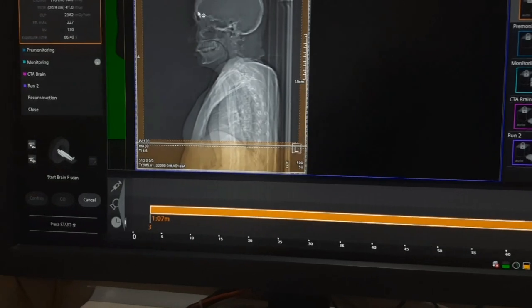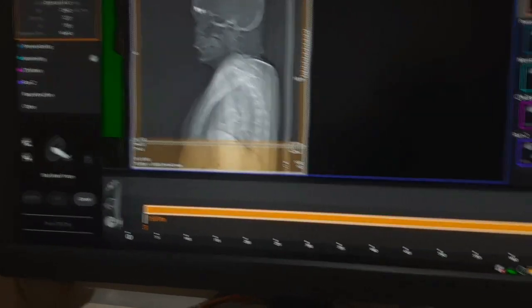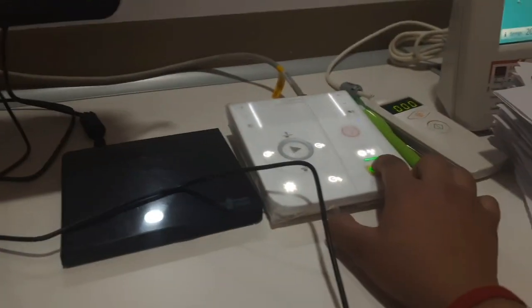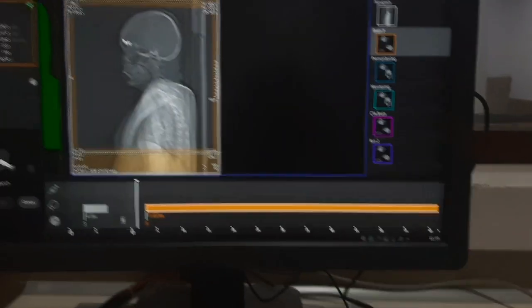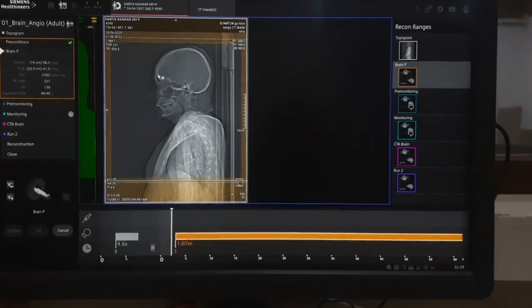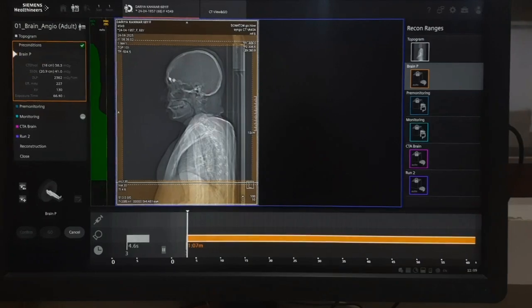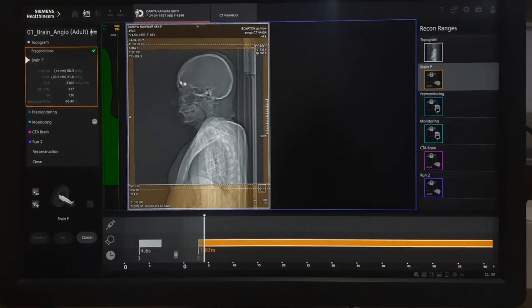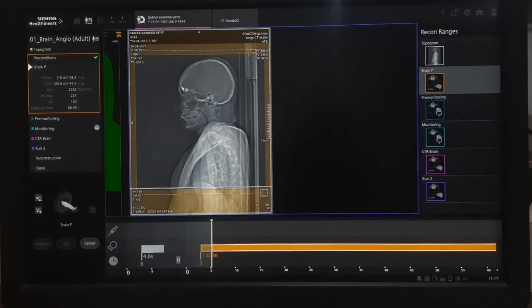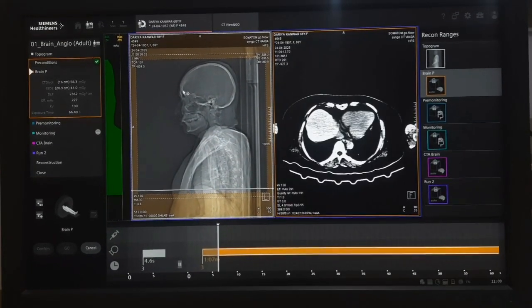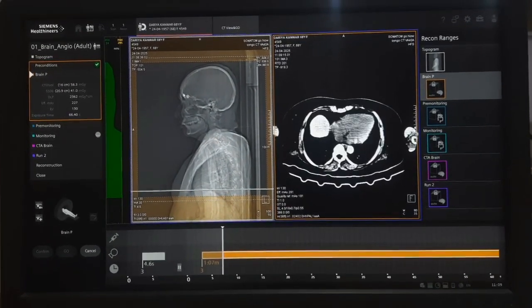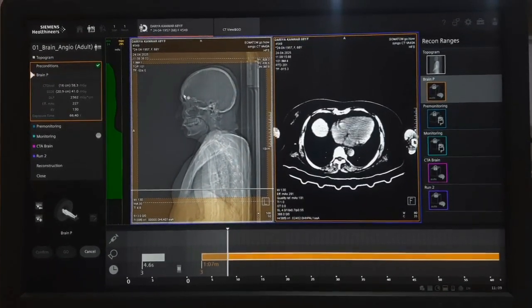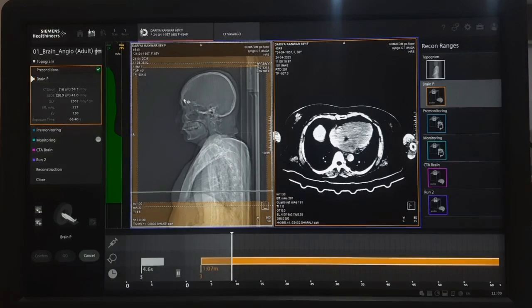Before starting, press move to capture the brain scan. Now the brain scan has started.